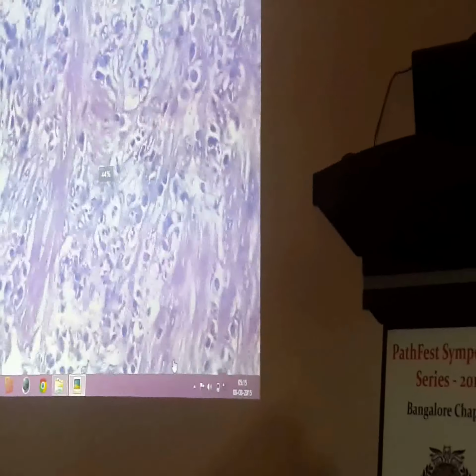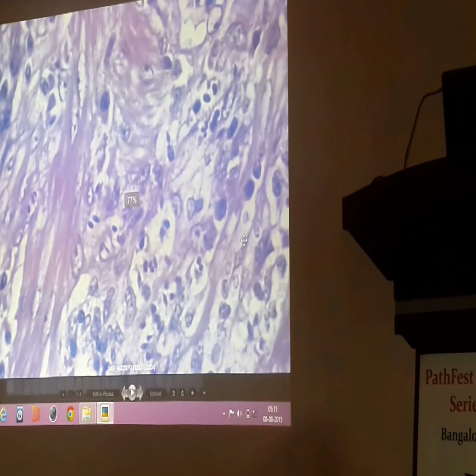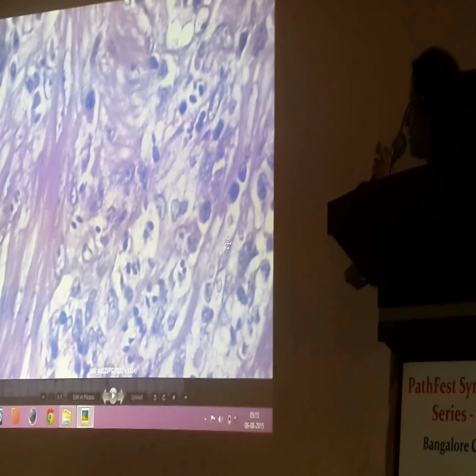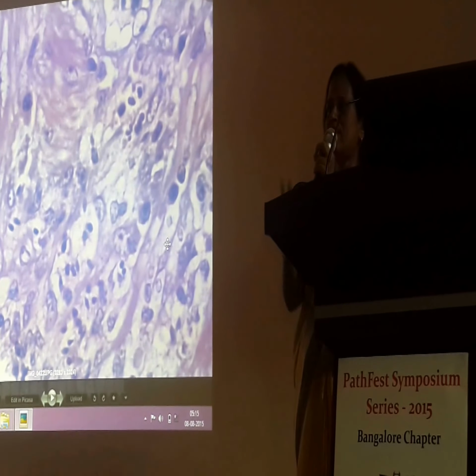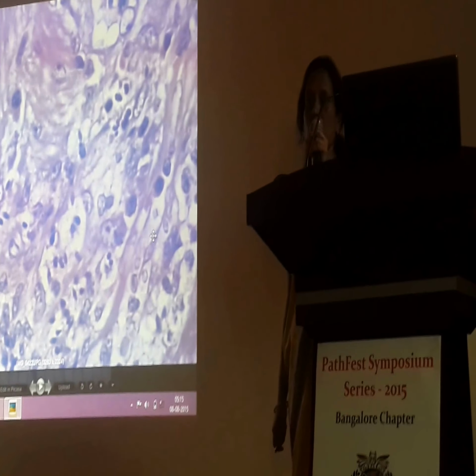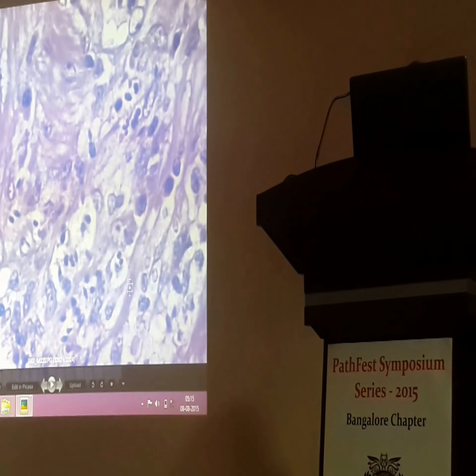So this is in the wall. Can you appreciate the sperm heads in the wall? Yes, the smooth muscle. And look at this. So sperm granuloma is another slide that you could get in the examination. Next. Go to PPT.